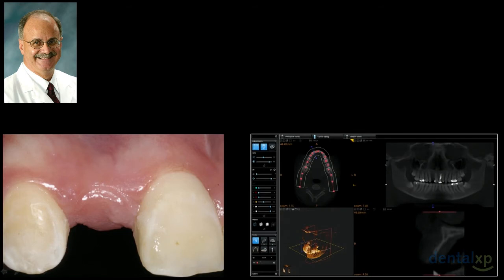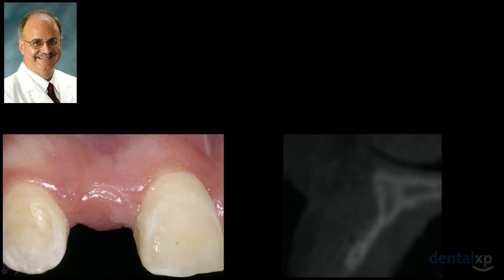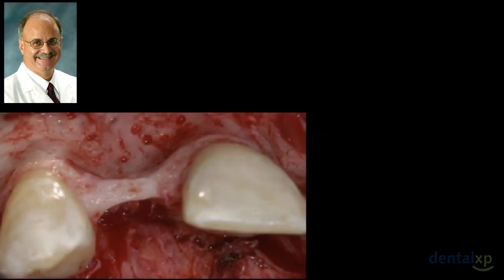But if we really zero in on this, and I do have the CareStream 9300, in all 3 of our offices, we've had it now for some 1.5 years, almost 2 years. We replaced the 9500 with this. It's a beautiful system, beautiful unit to play with. Here, look at that. Anybody care to ridge split that? I mean, really, how thin is that? Well, the reality is Victoria's got an issue not only on the facial, but where else? On the palatal. Now, what can we do here?